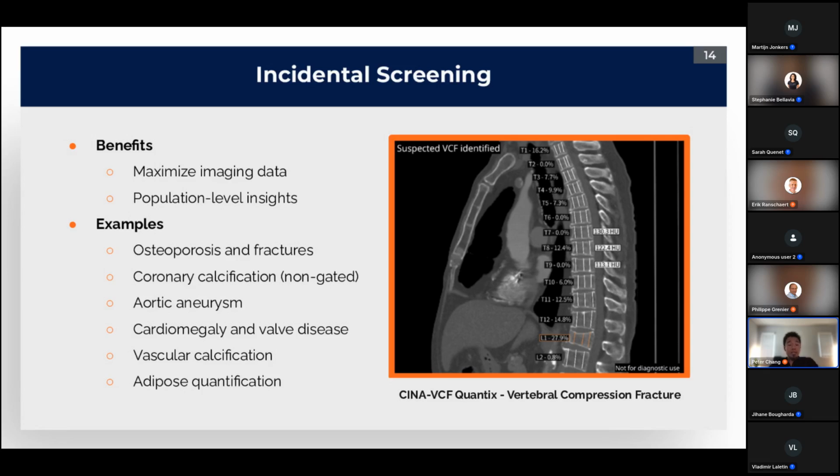A classic example here is in the case of osteoporosis and bone mineralization measurements. A chest CT, which is again oftentimes ordered to evaluate acute pathology, pneumonia, heart disease, in fact is also a study where all your thoracic vertebrae are visible. And it certainly would make sense that the density of your bones on that study correlates to your likelihood of, again, decreased bone mineralization, osteoporosis, fracture risk. But it's not really something anybody studied until about a decade ago.